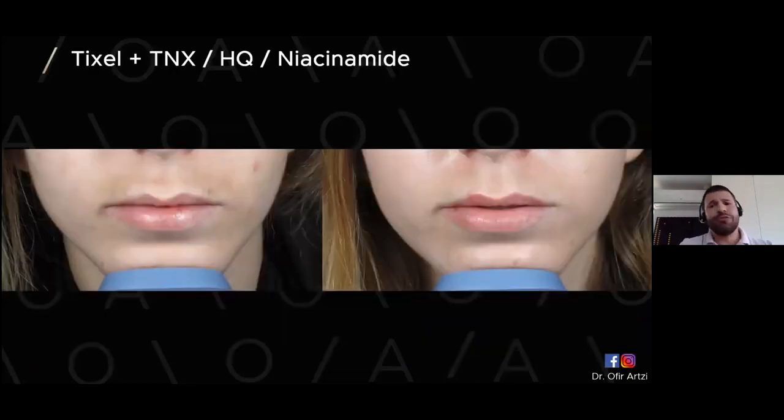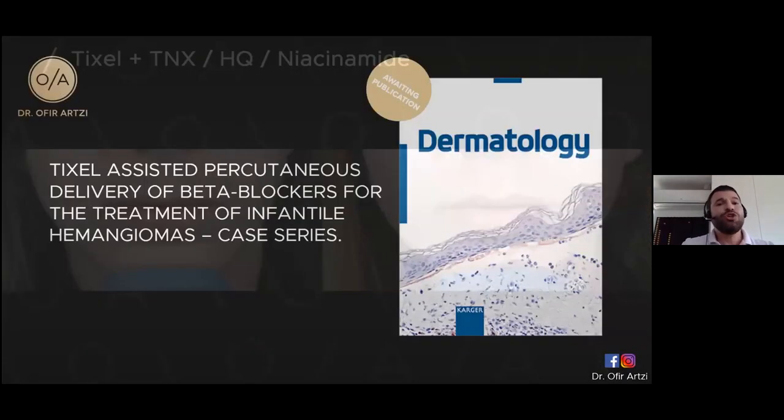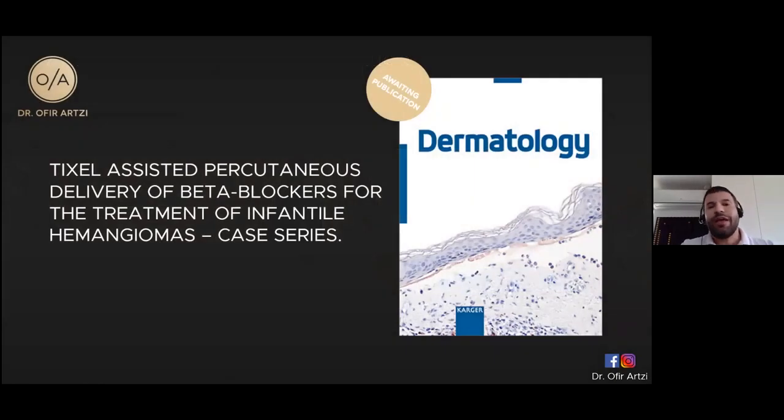I use the Tixel for many indications. For example, for melasma, which I'm sure cannot stand as a monotherapy, but we use Tixel in order to deliver tranexamic acid or hydroquinone or niacinamide. We use it for different, very unique indications.